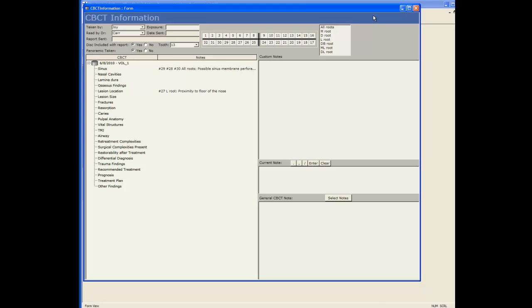This will bring up your CBCT information page where you can enter all of your findings. The top section is general information about the scan including who took it, who read it as well as the exposure and if a panoramic was taken.